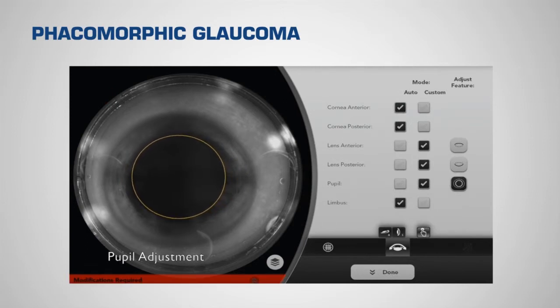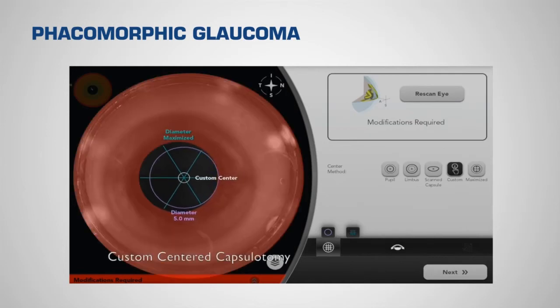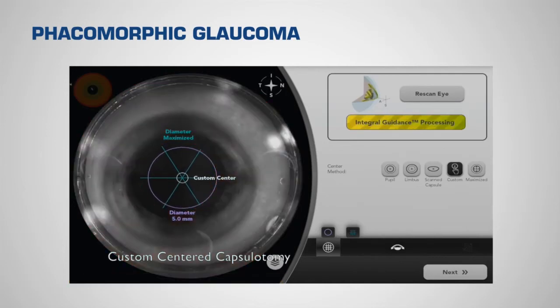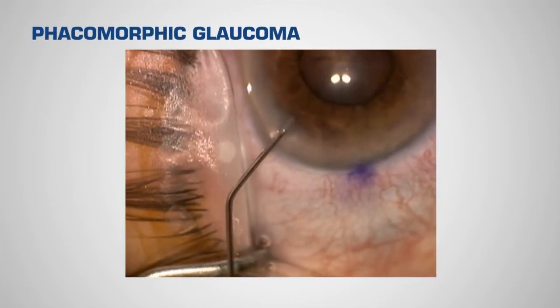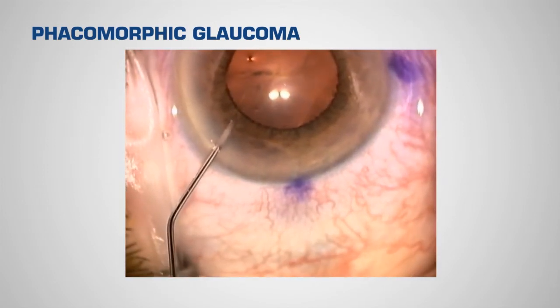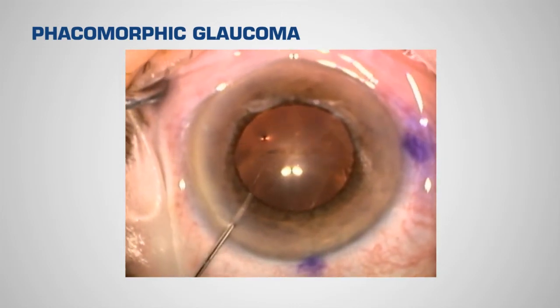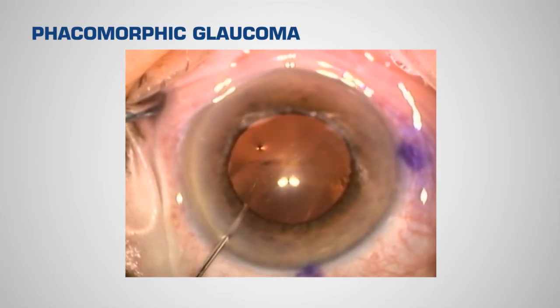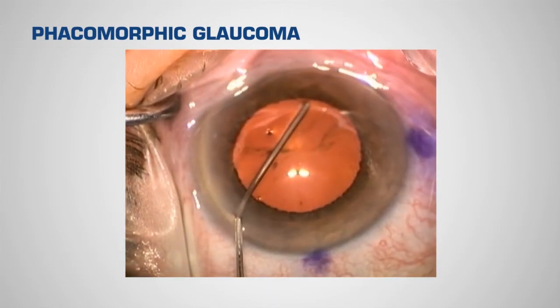The patient was quickly moved to the operating table where removal of viscoelastic enabled release of the reverse pupillary block configuration, and the remainder of the case was completed uneventfully. Now for her second eye, our goal was to avoid the occurrence of reverse pupillary block. Similar to the first case, we used epinephrine to achieve preoperative mydriasis and were careful to inject epinephrine above and below the iris. We did not use any viscoelastic to deepen the anterior chamber.